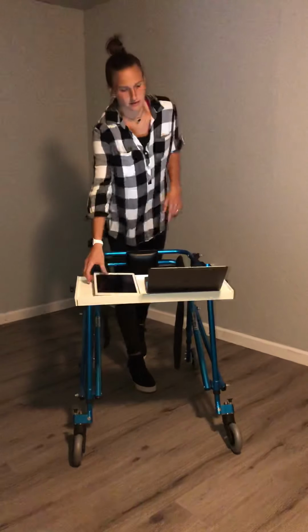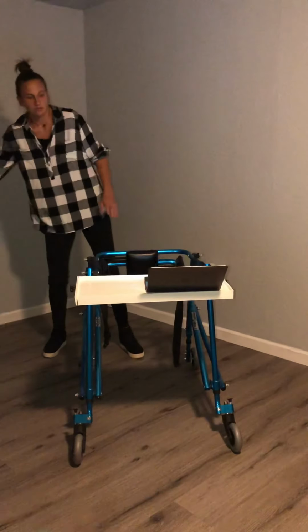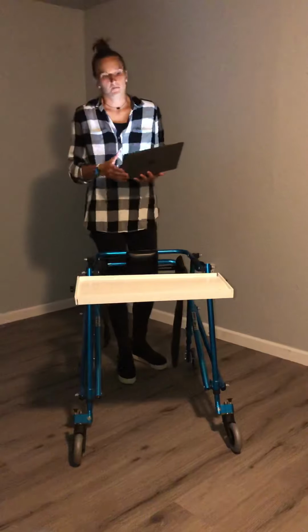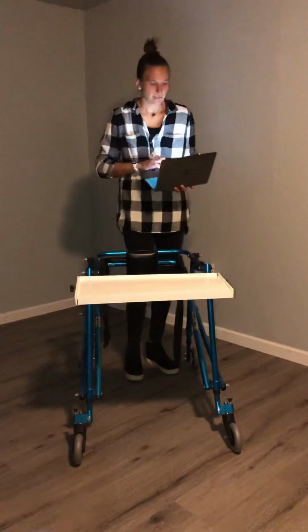There are some posterior walkers that actually have seats, and so a child could utilize this as an actual workspace to where they can sit down and do their homework. But this one does not have a seat. Some of them do, so that would be beneficial to them.